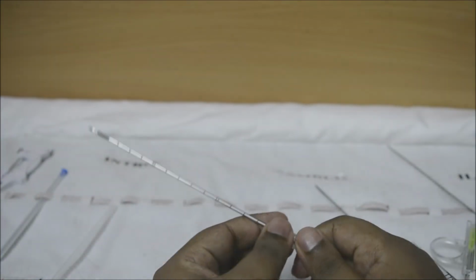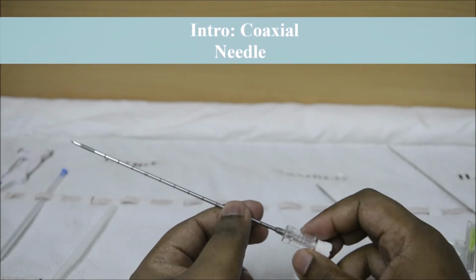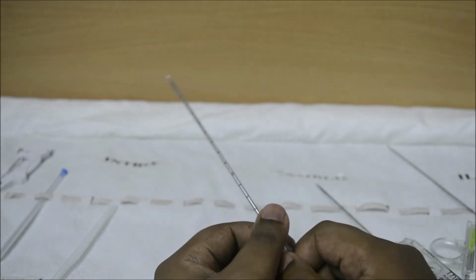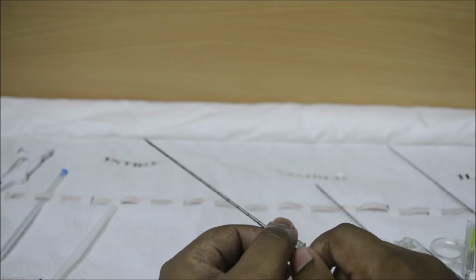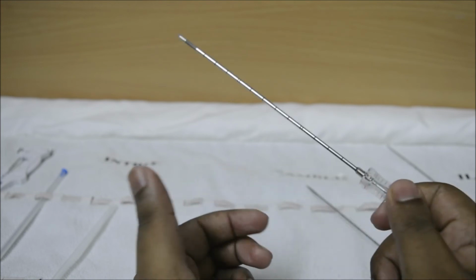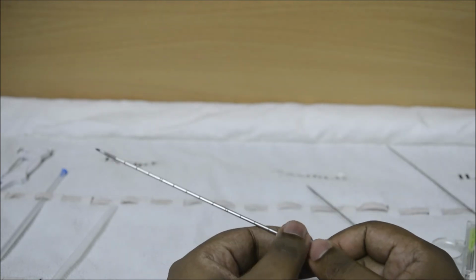Okay, the another type of needle which we have is called the coaxial needle, and our coaxial needle is called the intro needle. So what is a coaxial needle basically? For example, the doctor needs to perform 2 or more procedures, for example a biopsy as well as a marker insertion, or else making a channel. It depends on the doctor how many procedures he or she wants to perform.